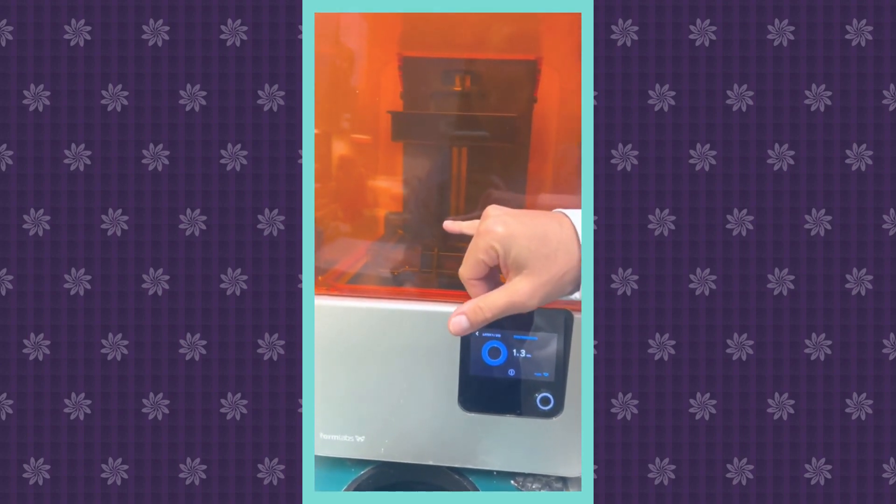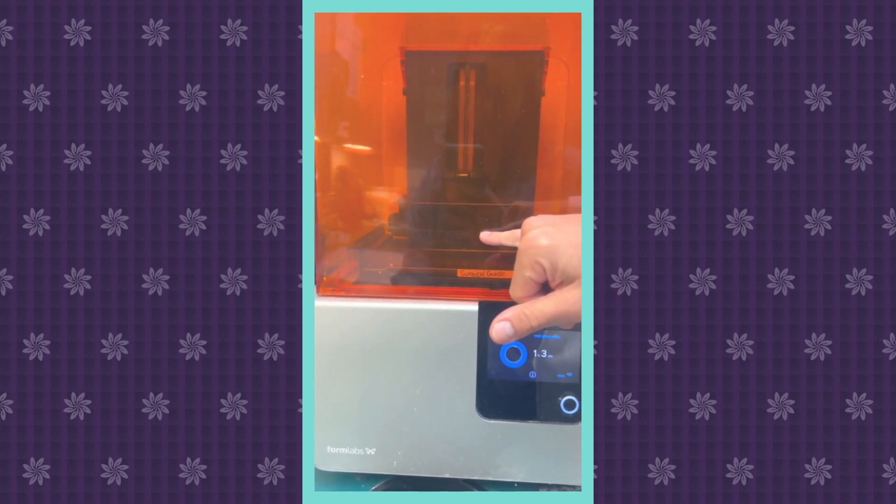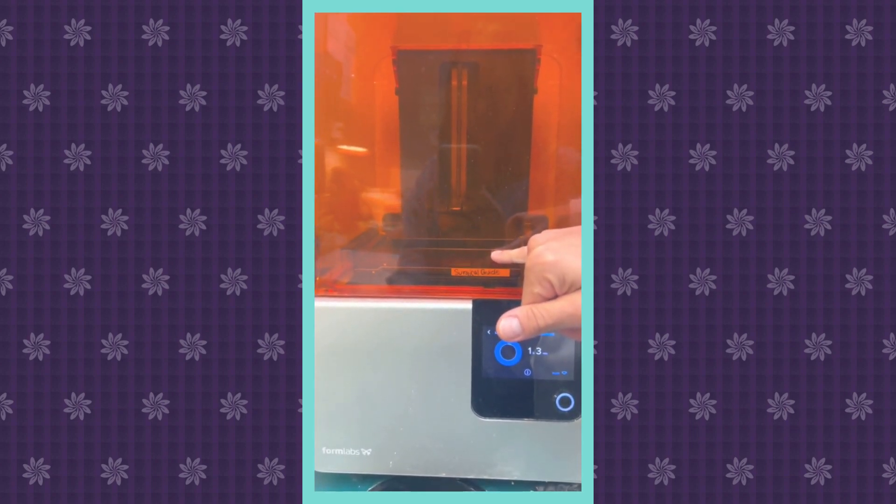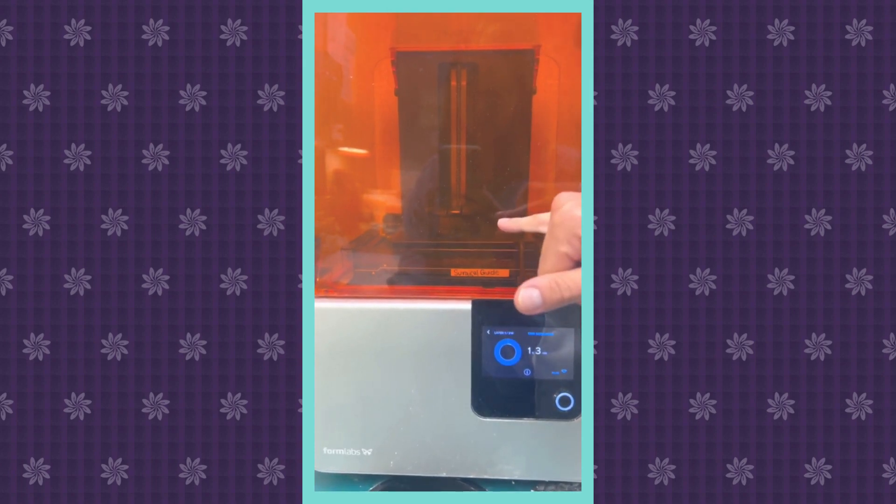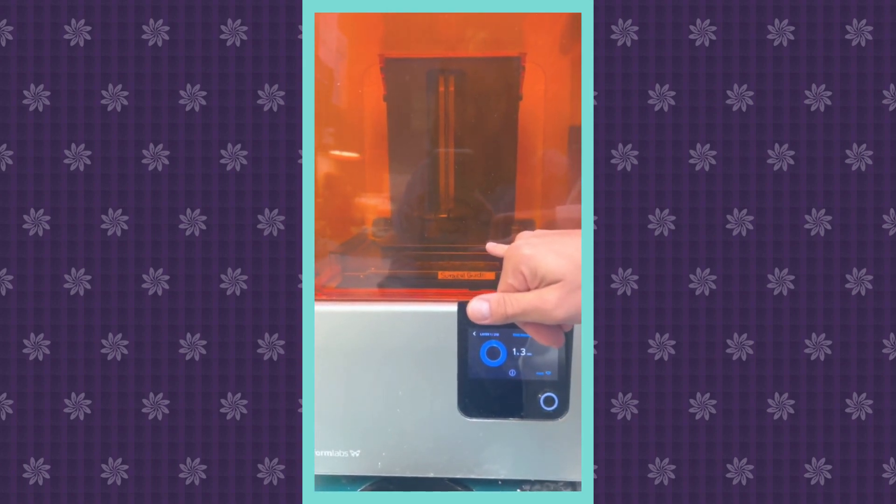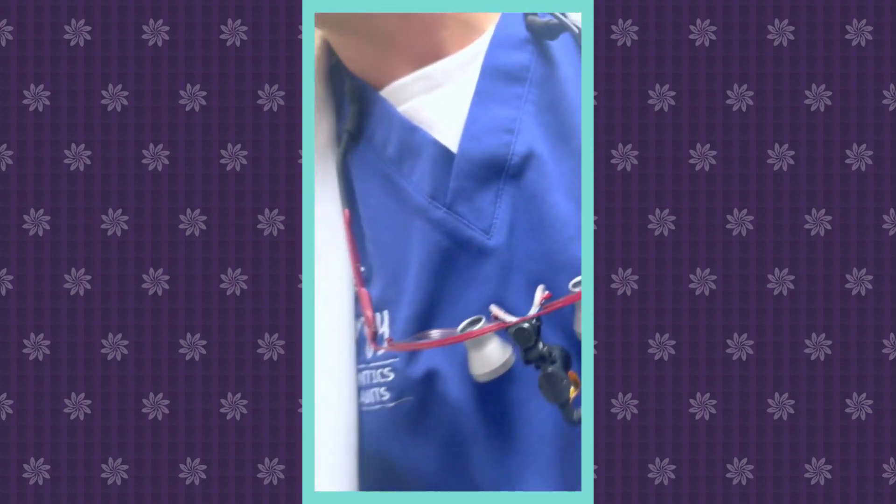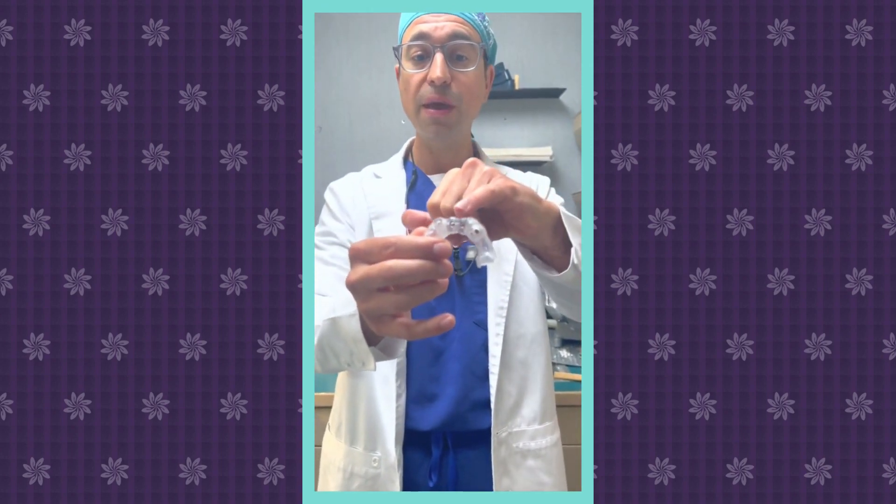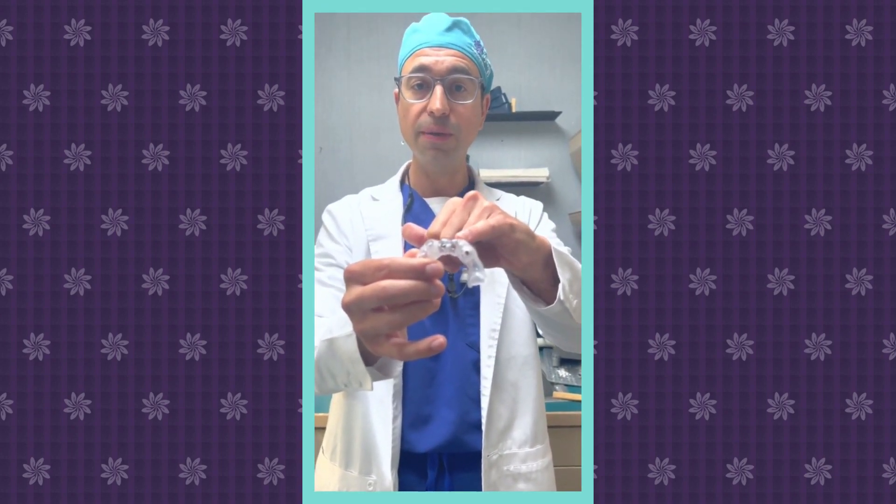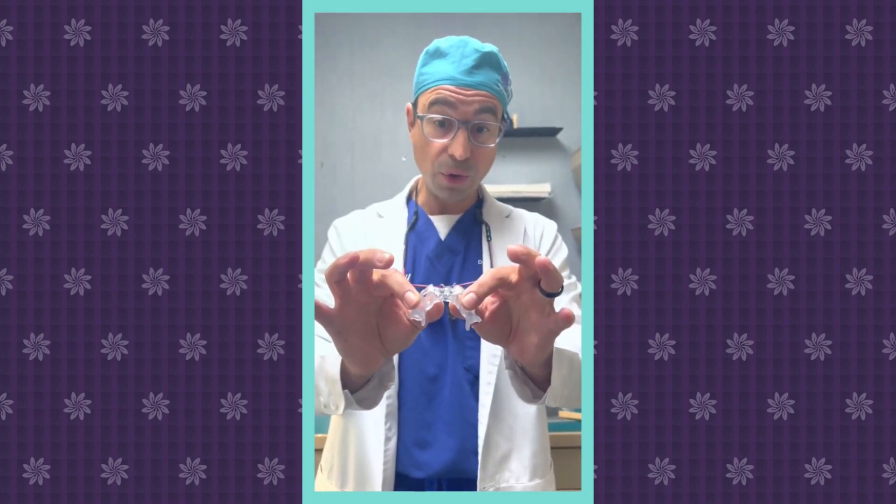Now our 3D printer basically makes the surgical guide that I showed you out of resin, and it's going to start printing the 3D guide right now, which I'm going to utilize during surgery after we disinfect it. And the 3D guide is going to look kind of like this, similar to this. So the implants will be placed exactly where they need to be. And that is how we are accountable for perfect results every time.